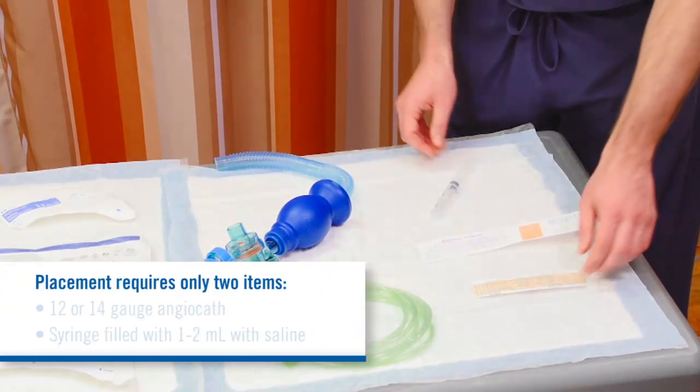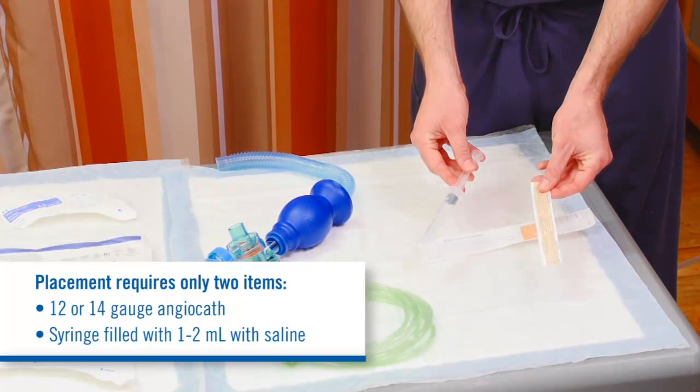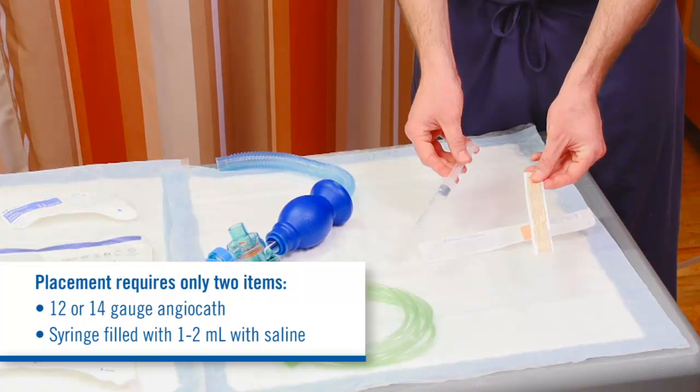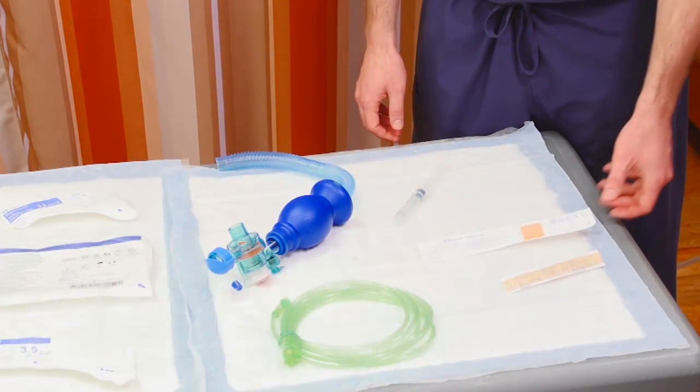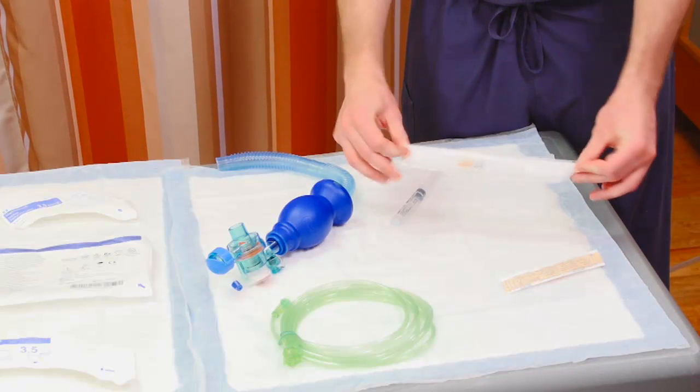Placement requires only 2 items: a 12 or 14 gauge angiocath and a syringe filled with 1 to 2 mL of saline. Readily available safety or AutoGuard needles found in most emergency departments, the ones used to start IVs, won't do.